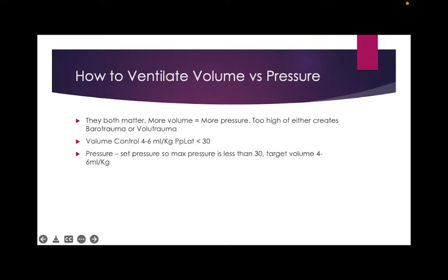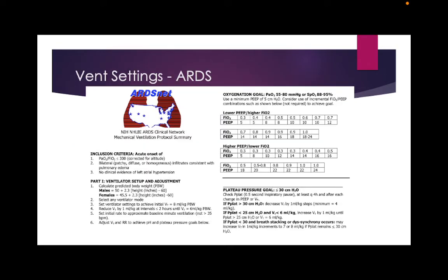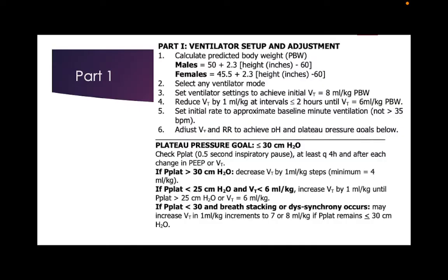So if you're already confused, it's okay. There's something called ARDSNet, and I referenced them earlier. You can Google ARDSNet ventilator card, and this will come up, okay? It includes our diagnosis, and then we're going to go through step by step what they've got on here. So, ventilator setup and adjustment.